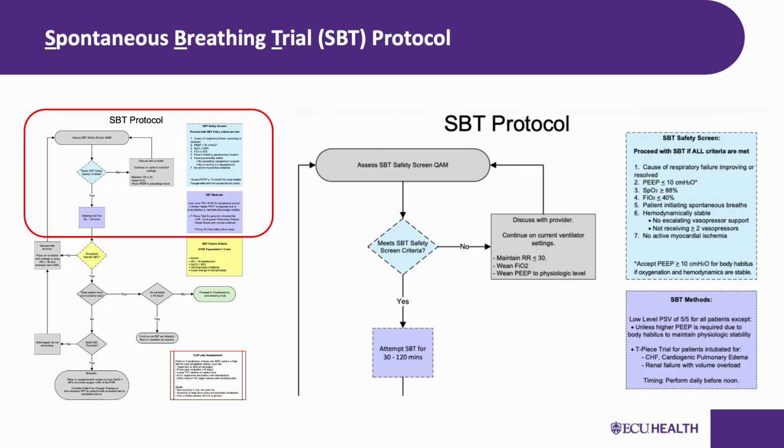Similarly, NIF, or negative inspiratory force, has been shown to be an unreliable standalone predictor. A study by Coe and colleagues in neurocritical care found that none of the individual weaning parameters, including NIF and RSBI, predicted extubation failure. No single parameter and no combination of parameters accurately predicted who would fail. So what does predict extubation success? The SBT itself. The patient's real-time performance during the 30 to 120 minutes of minimal support is the best assessment we have. That is why the SBT is the cornerstone of our protocol, not the parameters.